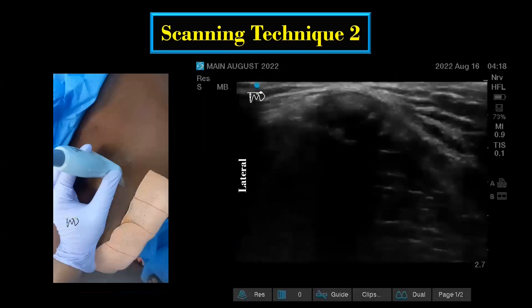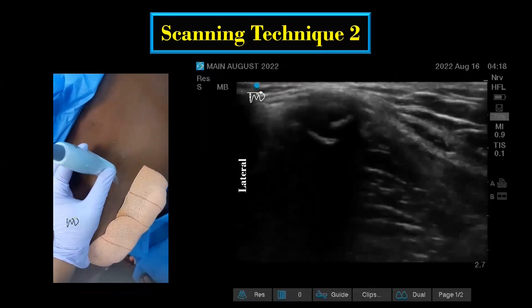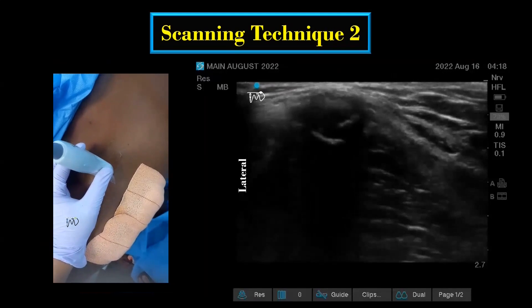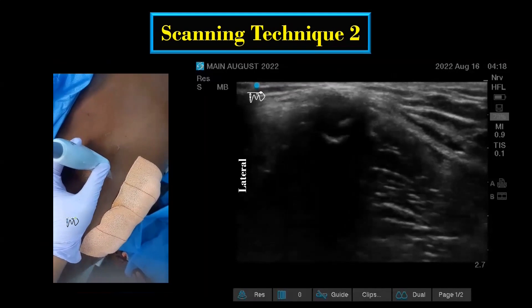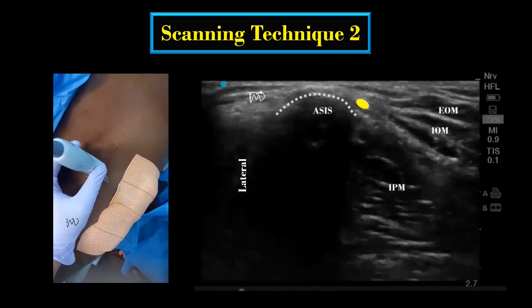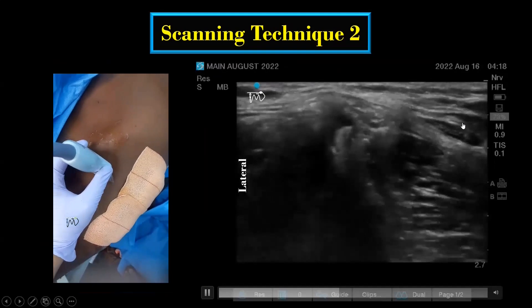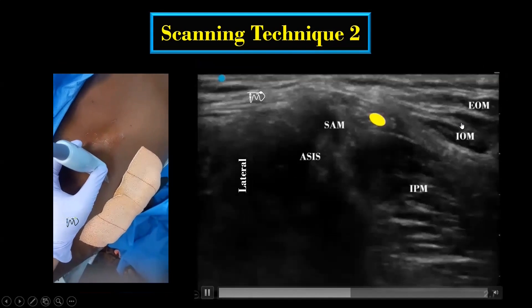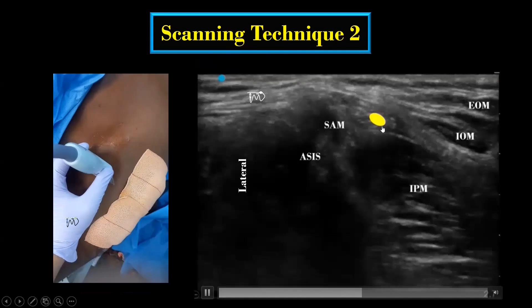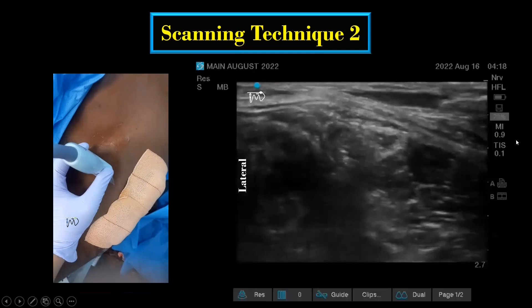In the second technique, the scanning starts by placing the transducer transversely on the anterior superior iliac spine. The probe is then moved caudally. At the level of the inguinal ligament, the LFCN can be visualized just medial to the anterior superior iliac spine. On further distal scanning, it can be seen above and medial, and subsequently lateral to the sartorius muscle.